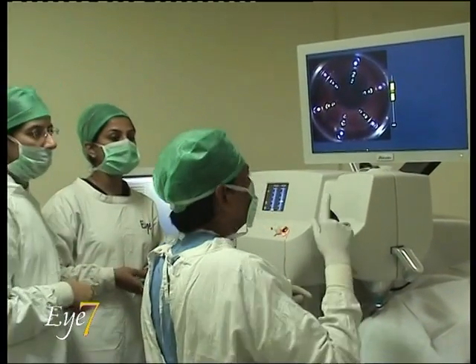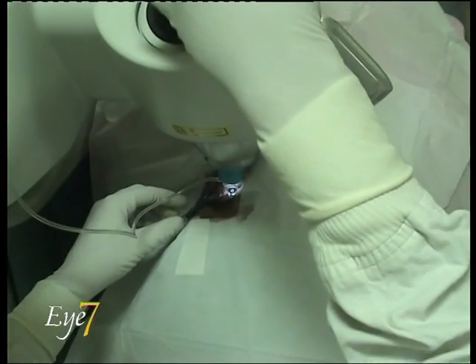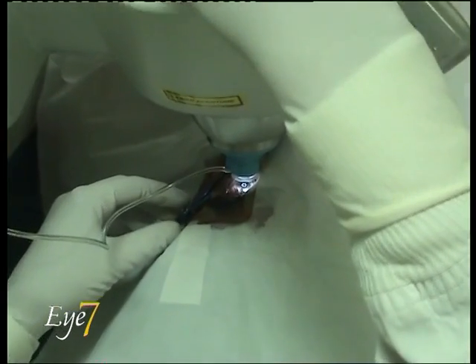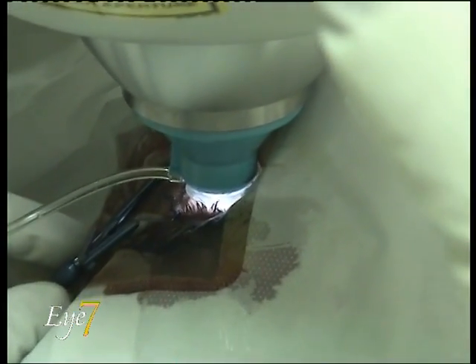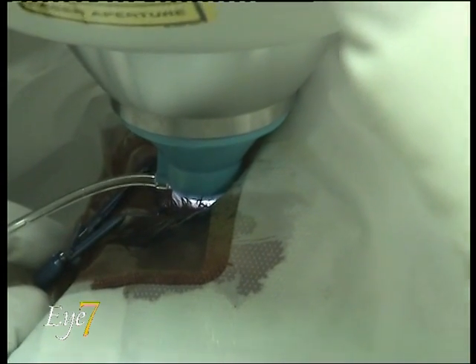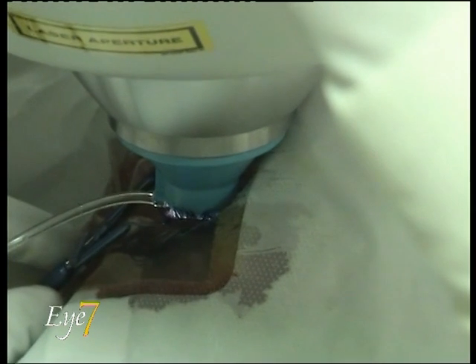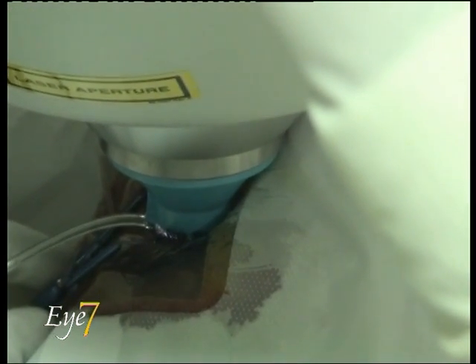This is a presentation on femtosecond laser cataract surgery, and you are seeing the LensX femtosecond laser. The femtosecond laser has a patient interface — this blue device which is on the tip of the laser — and with this, the laser docks onto the eye of the patient.